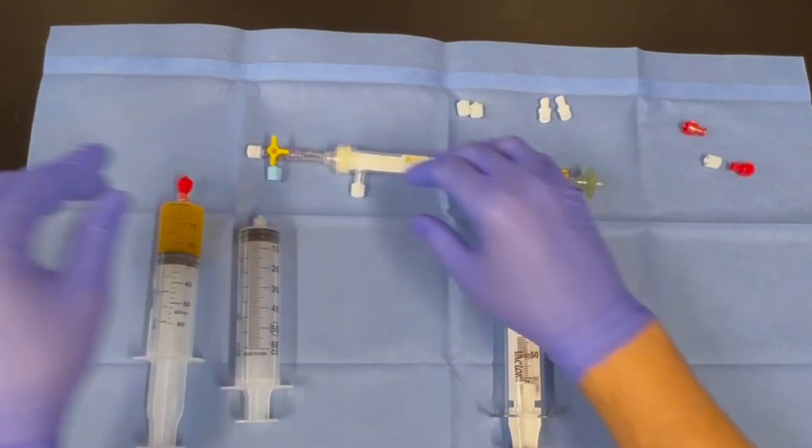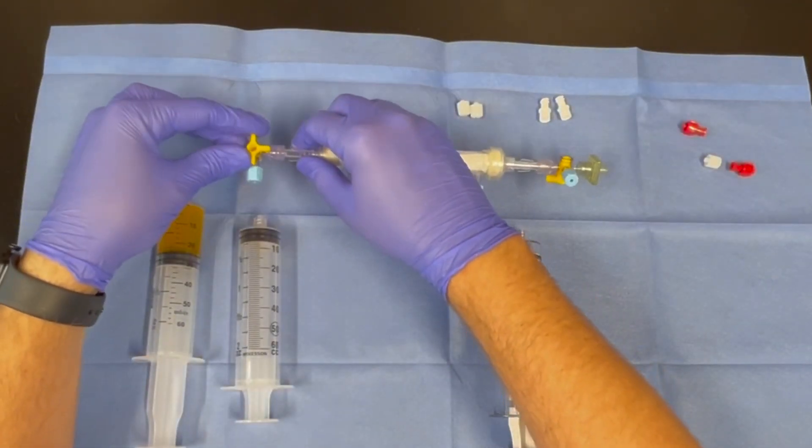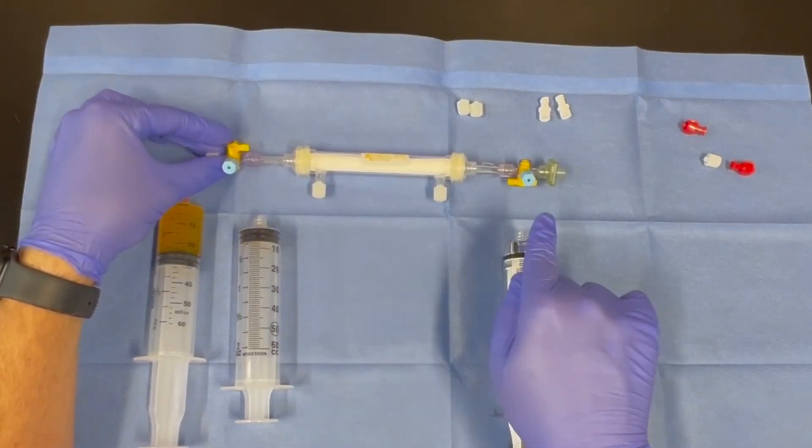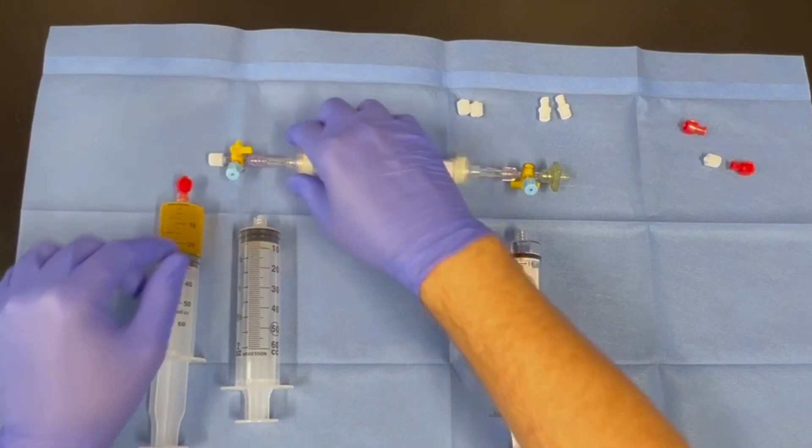Make sure that the 360 degree luer lock attachment is fully tightened. Remove the white cap from the end of the green filter. Move to the left side of the filter and confirm that the blue cap is angled slightly up towards you and tighten the 360 degree luer lock attachment.